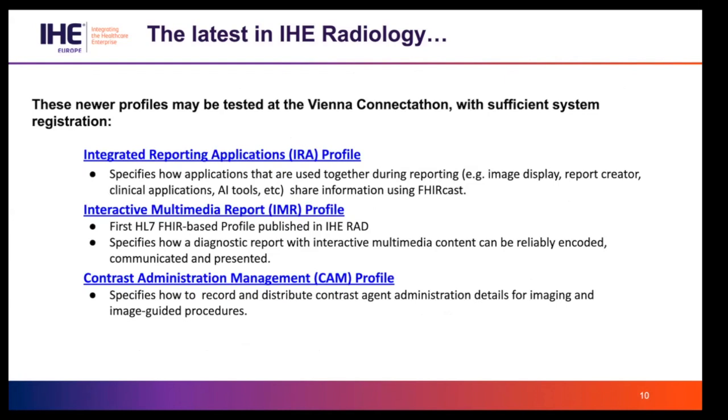There are newer profiles which have been in trial implementation for about 2 years or so. The integrated reporting applications profile, which is dealing with multiple applications a radiologist uses to create a diagnostic report, exchange the information and staying in context, and exchanging the content as a process of creating that report.